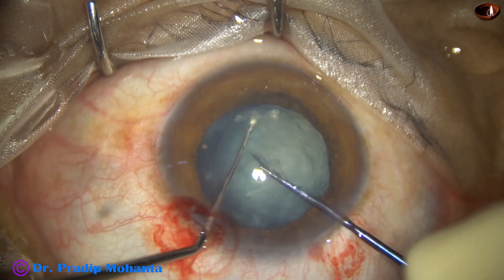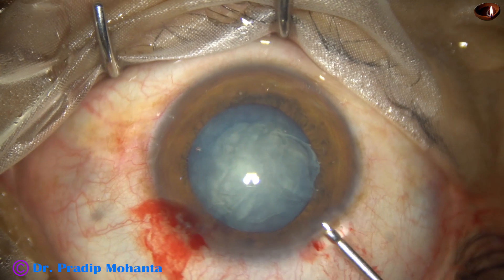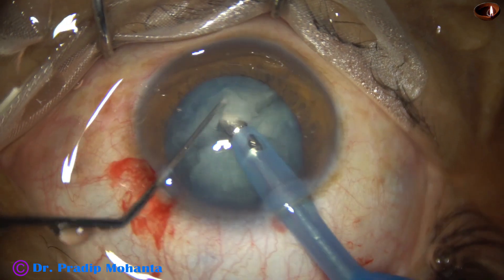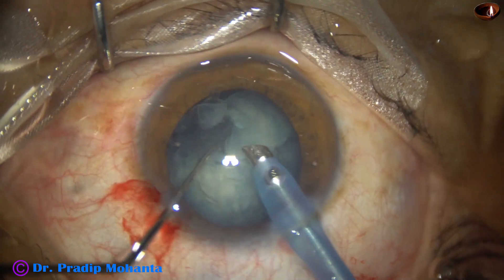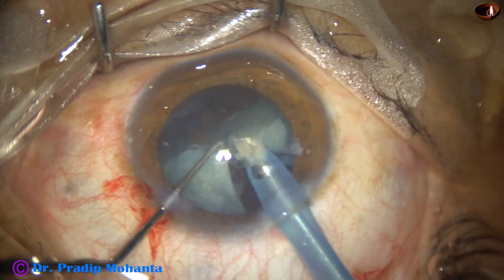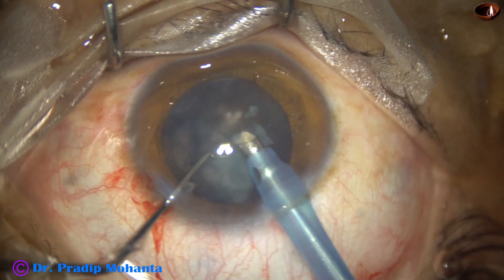Now I attempt to divide the other hemi-nucleus as well, and inject some more visco. Then the phaco needle goes in. You can see that the nucleus is soft, and the pre-chopper helps in such cases, because with such a soft nucleus we cannot hold it — if we try to hold it we just eat up the lens matter right in front of the phaco needle. So pre-chopping helps in such cases.